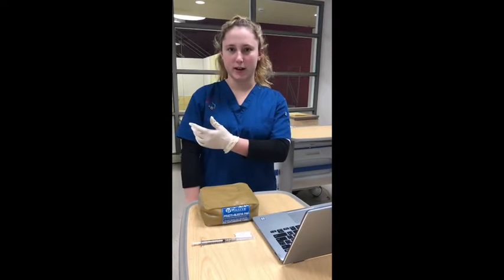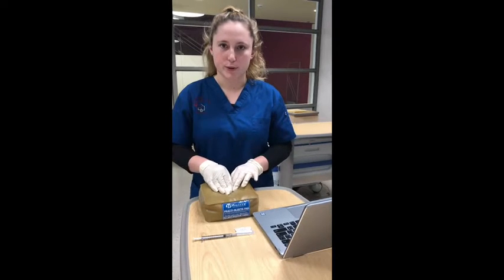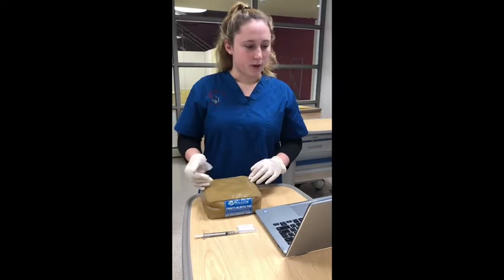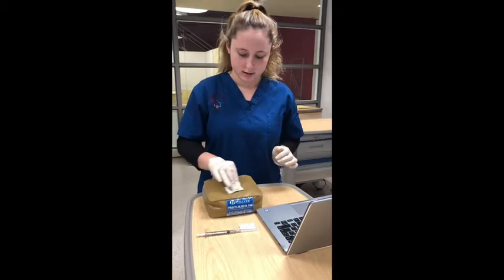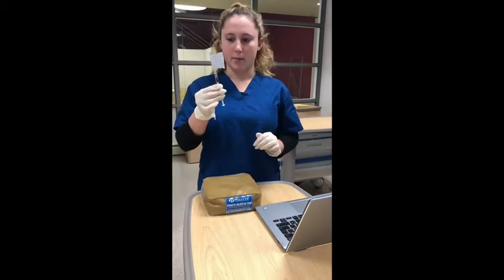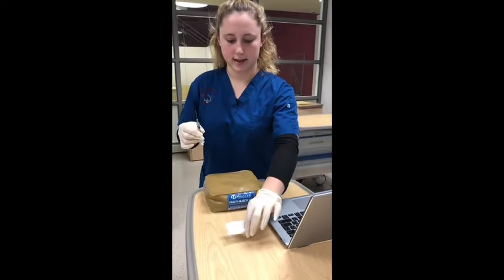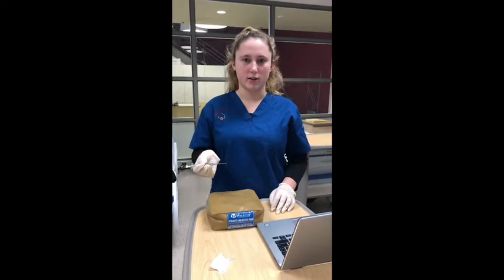So now I'm gonna be doing my intramuscular injection into Mr. Mancini's deltoid. So I would start again with palpating, looking for any lumps or bumps or bruising in that area, and it looks to be good. So what I'm gonna be doing first is I'm going to clean my injection site, and then throwing that in the trash bin. And then I'm going to be removing the cap on my needle and setting that down. So for an intramuscular injection, I would do it at a 90-degree angle to the muscle.